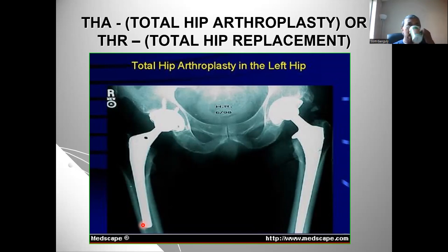And similarly, cement can be placed inside the cup area also. After the cup is reamed with the cup reamer, the cement can be placed inside, and this shell can be pressed tightly against that cemented cup. When the cement solidifies, it holds that shell solidly together with the hip cup. So then we have a cemented arthroplasty joint.